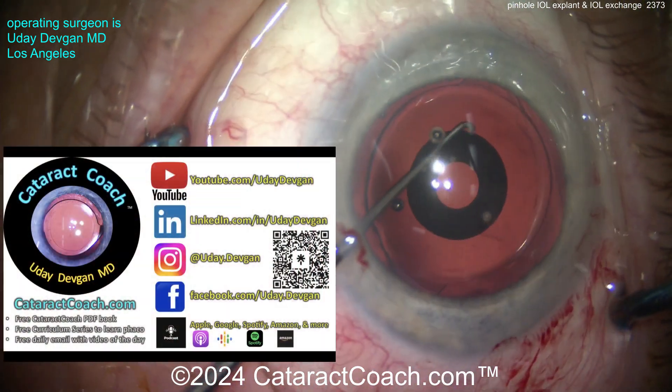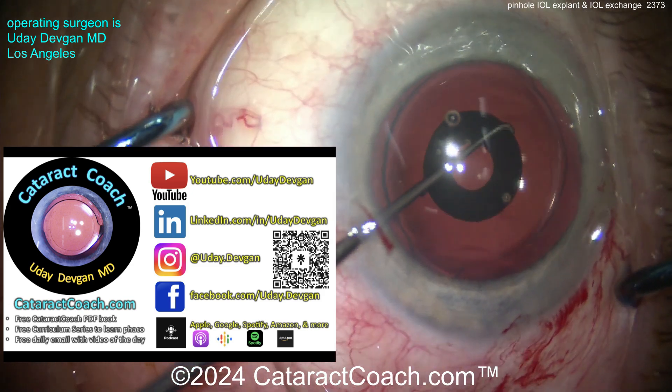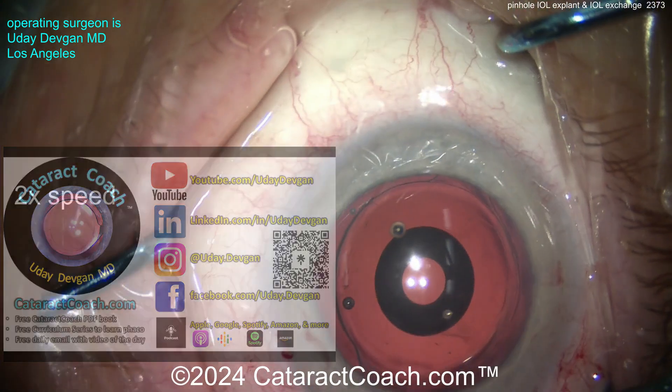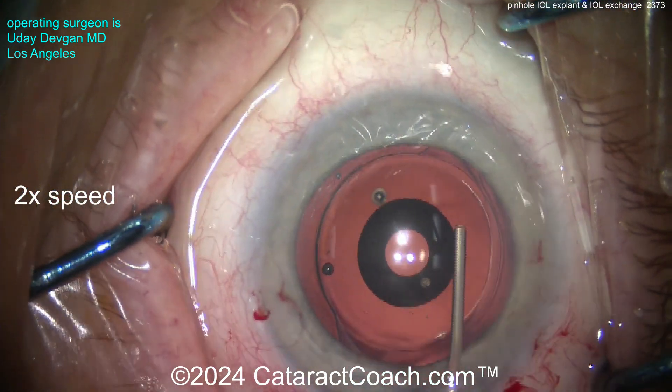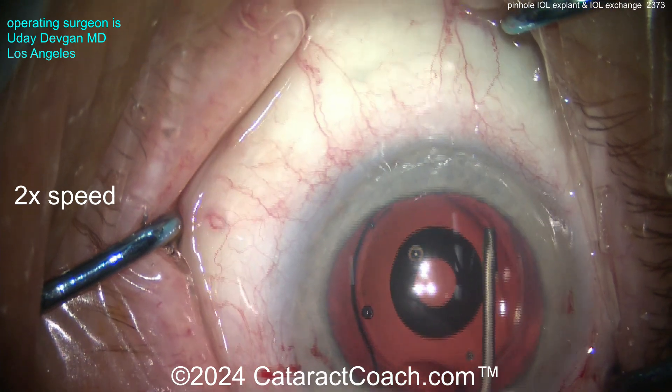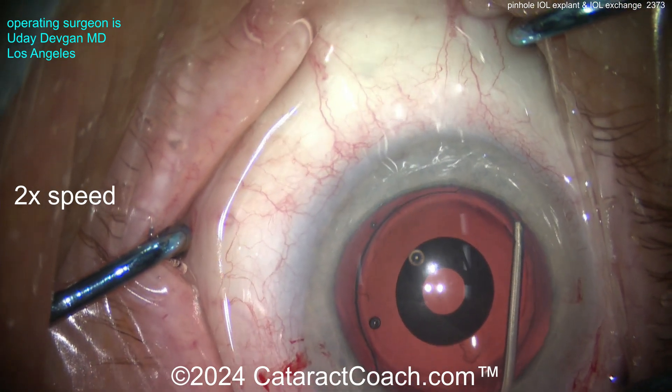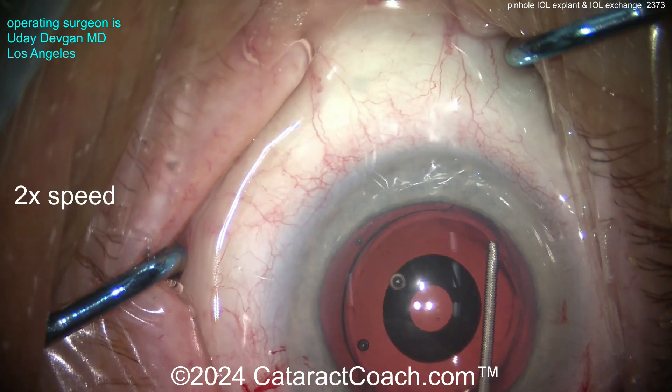Now going on the other side — slow, meticulous dissection using a dispersive viscoelastic. Notice we have two paracenteses 180 degrees apart.